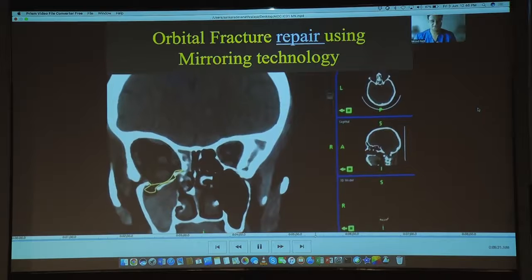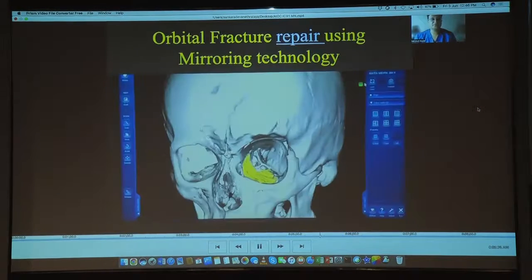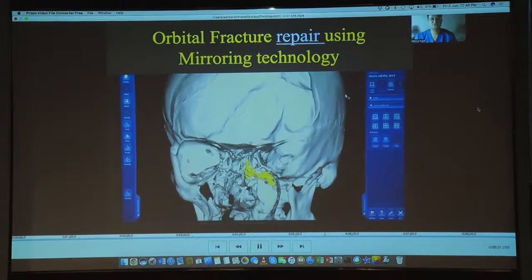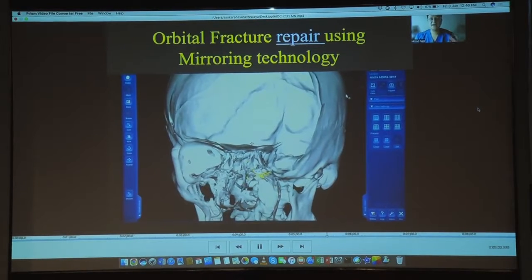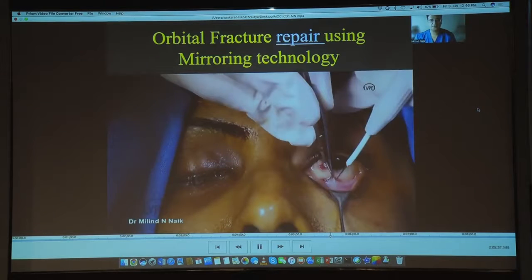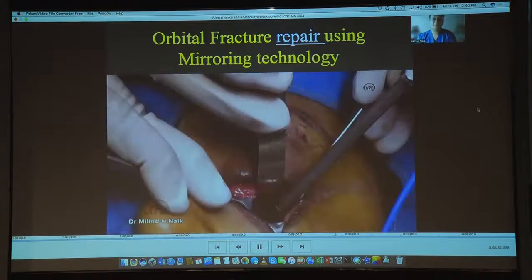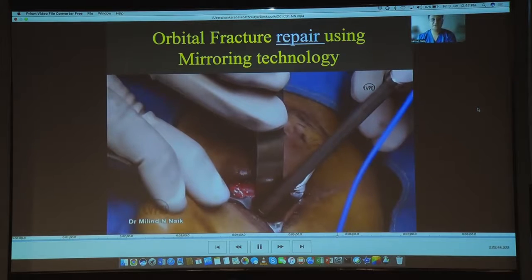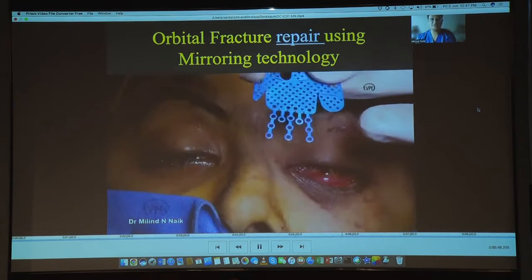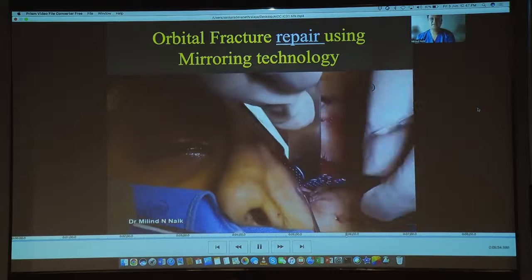Here you can see the manual marking of the expanded space, which eventually creates a three-dimensional structure that serves as a guide during surgery. This allowed us to place an orbital plate and match it perfectly to the other eye. You can see the probe being placed on the plate so that we can match it to the contralateral eye and achieve an exact correction.